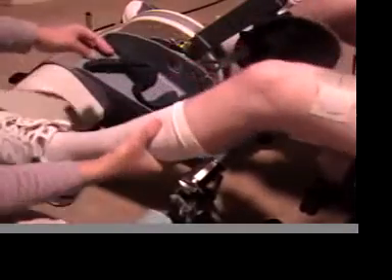When it comes to pad placements, you always want to keep your pads moist. Usually about two to three drops of water on each pad before and after a session will allow them to stay at a good level for your therapy session.